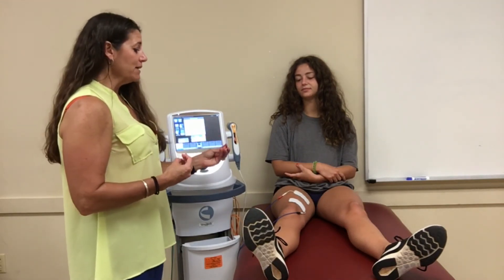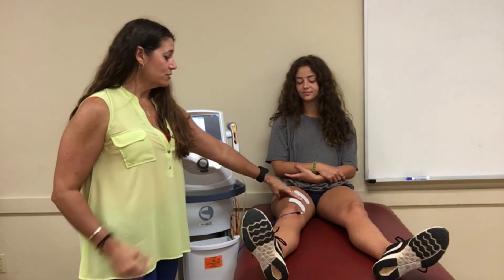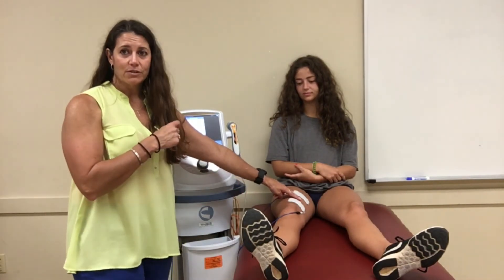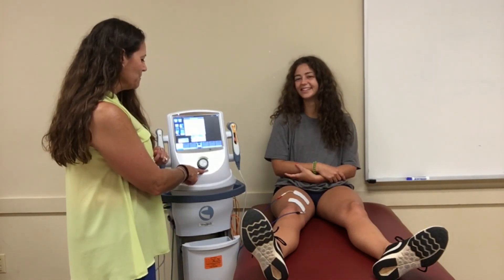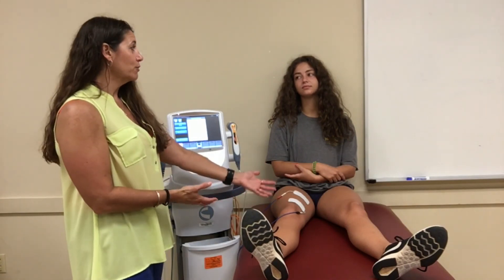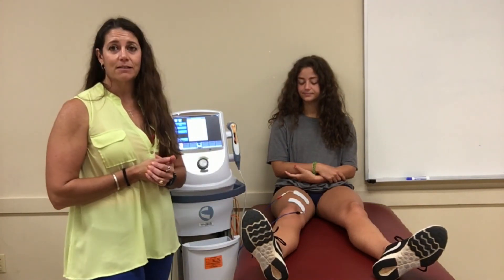For these treatments, I highly recommend you stay next to your patient and encourage them, because this is not a fun treatment — they don't like it and they don't want to squeeze. So I put my fingers there and say squeeze, you can do it, and continue that even after the electrical pulse goes down, so you're double-checking and they're feeling your touch as well. That tactile sensation helps them continue. When you're done, hit stop. Clear this treatment since we won't repeat it now, but if she were a regular patient I could save the protocol, name it Meredith, and use that exact same treatment each session — and you can do this multiple times in a single day.